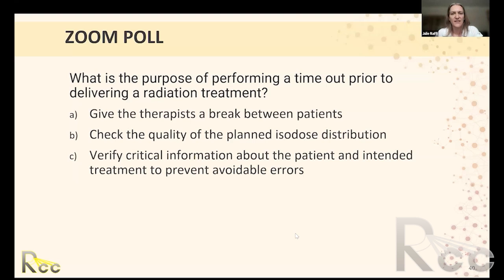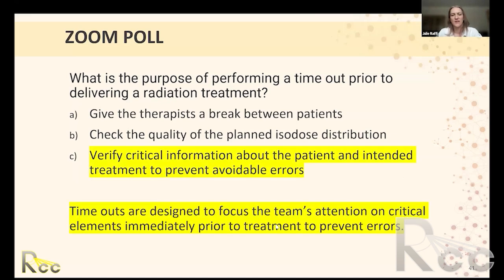So here are the results. Again, about 90% of the respondents got it right. We're wanting to verify critical information. Timeouts are designed to focus the team's attention on critical elements immediately prior to treatment to prevent major errors.